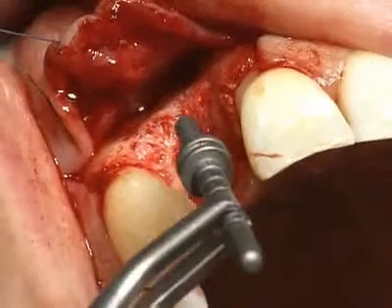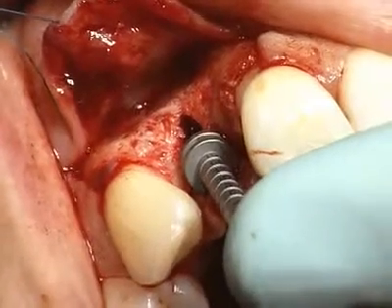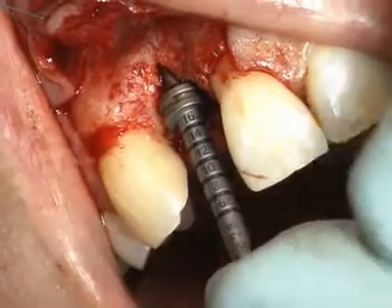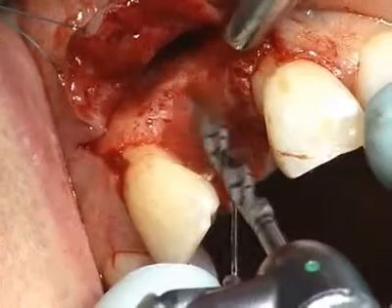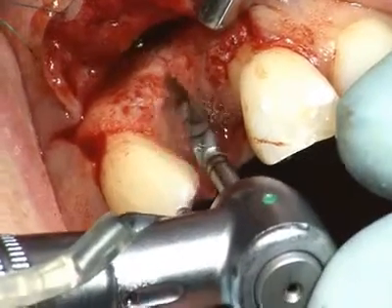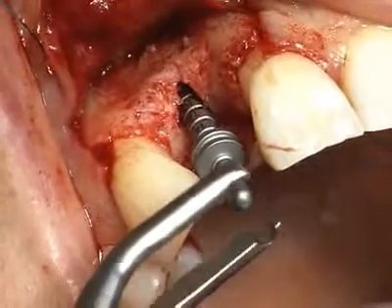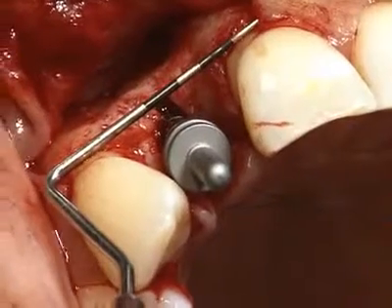The orofacial implant position is now checked with a 2.2-2.8 mm diameter depth gauge with attached distance indicator ring. The periphery of the 4.8 mm ring should be placed against the adjacent teeth slightly palatal or lingual to the periodontal probe. The implant bed is now widened with a second pilot drill, which has a diameter of 2.8 mm at a maximum speed of 600 rpm until the planned depth of insertion is reached. The orofacial position and the depth of drilling are again checked with the depth gauge. The planned position is now optimal. Seen from above, adequate vestibular bone availability is also apparent.